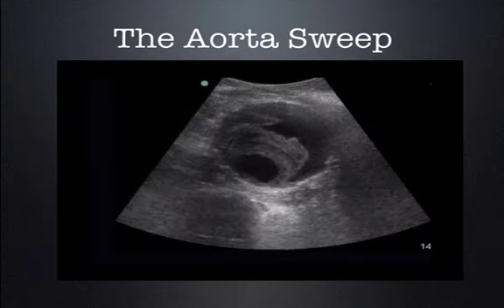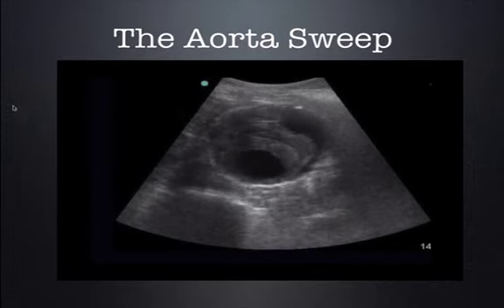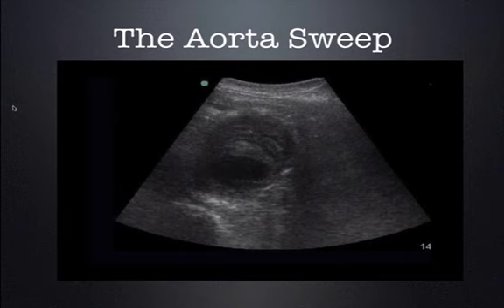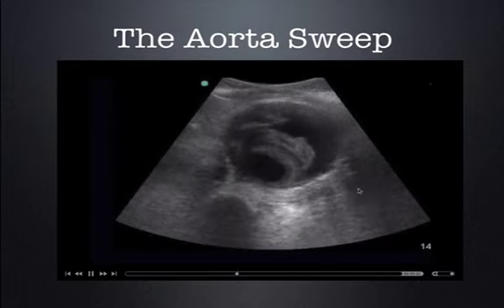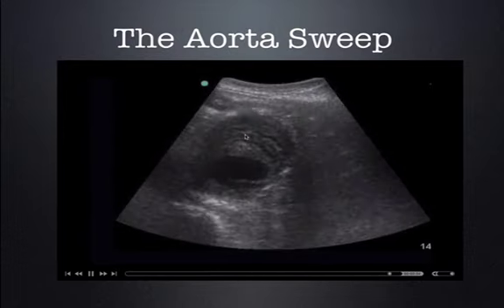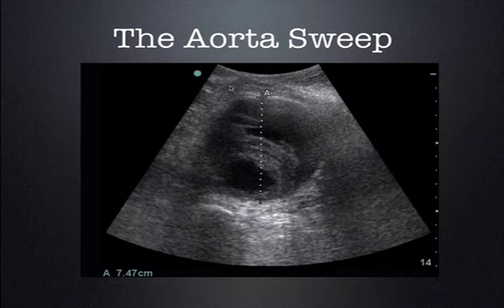Now, if on the other hand you see this, this is an abdominal aortic aneurysm. In a hypotensive, unstable patient who your gestalt is high for ruptured AAA, this is AAA. You assume it's ruptured. We don't see any free fluid. We don't care about that. This is in all likelihood a ruptured AAA. You call vascular surgery. This here is showing how to measure a AAA.